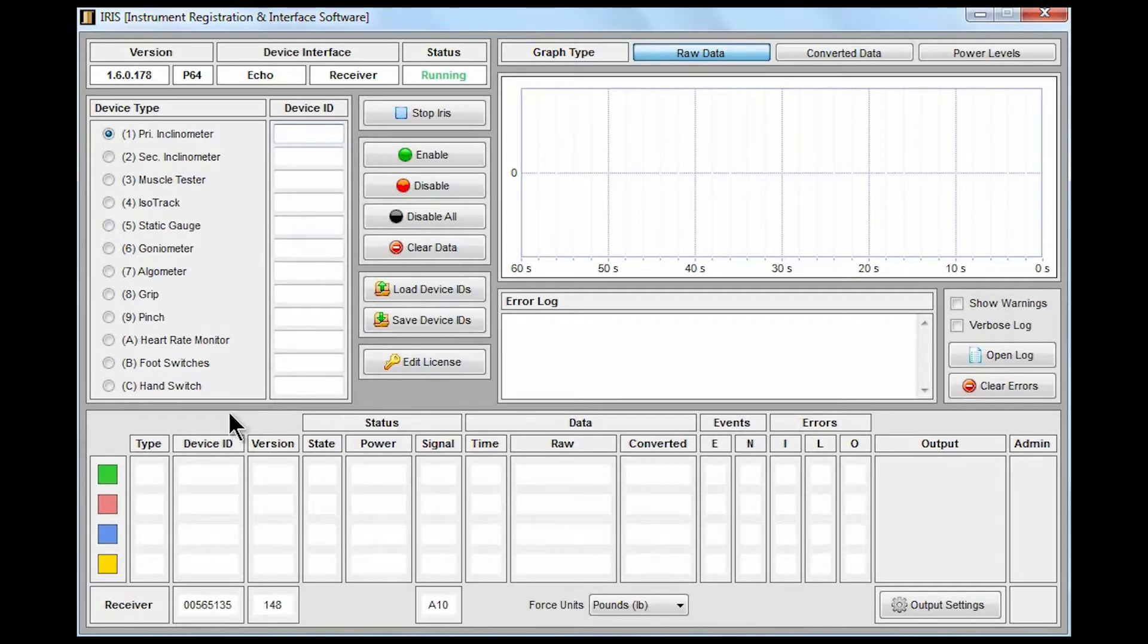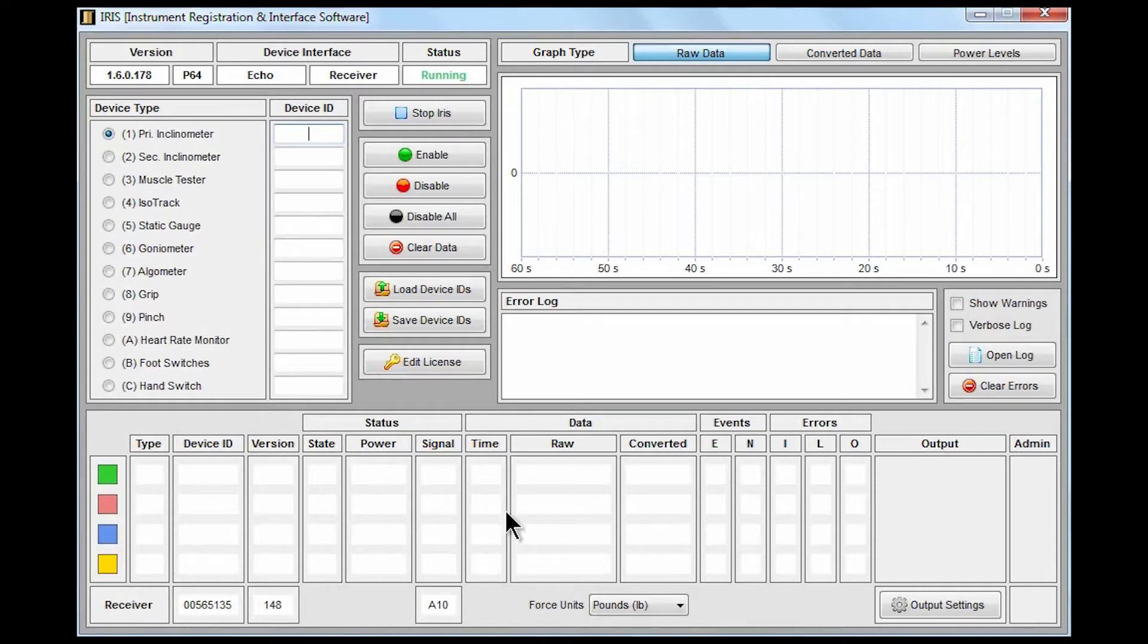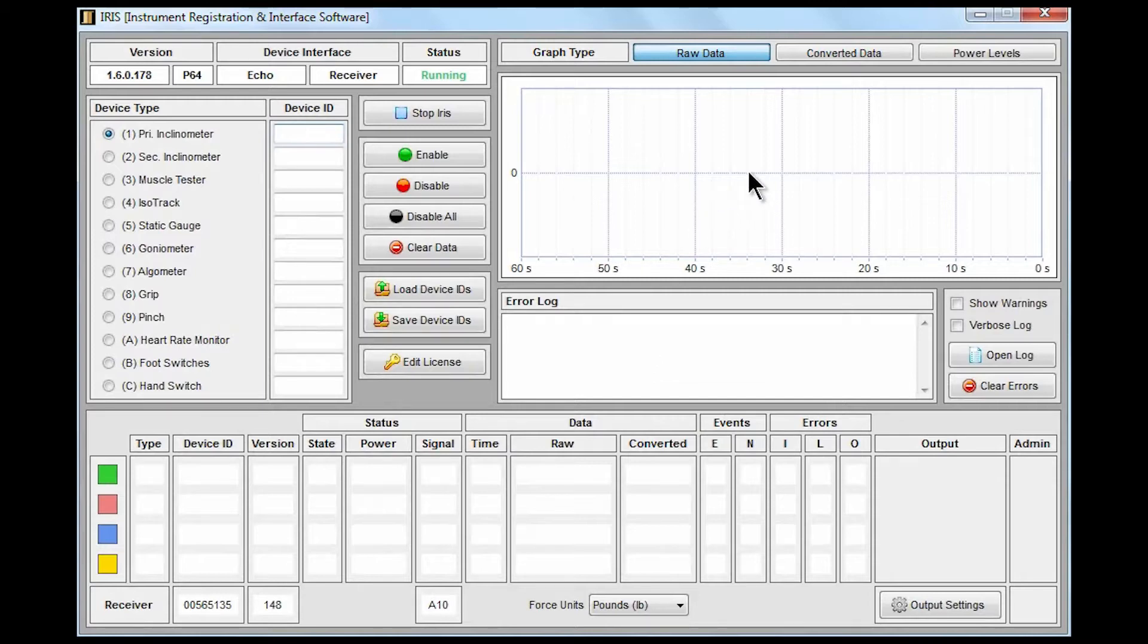Across the bottom we have a large status area which will give us the real-time status of a device once we begin to communicate with it and start to get readings. In the middle of the screen we have an error log that will eventually give us any feedback and results from the devices including error codes and other states. And then in the top right hand corner we have a graph area that will eventually provide us a real-time data feed from the instrument.